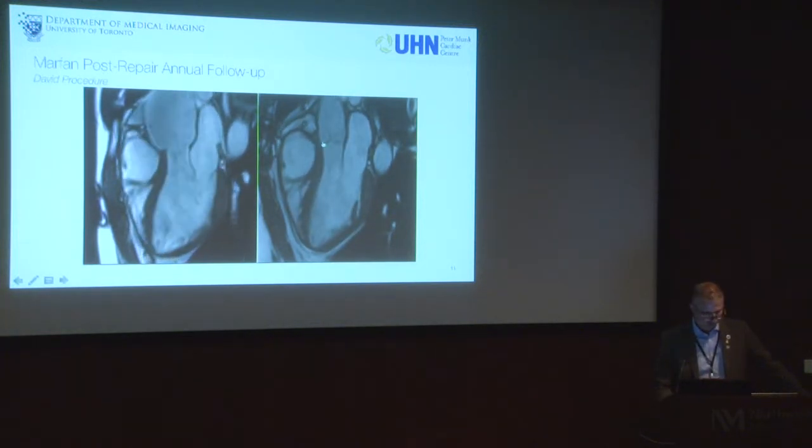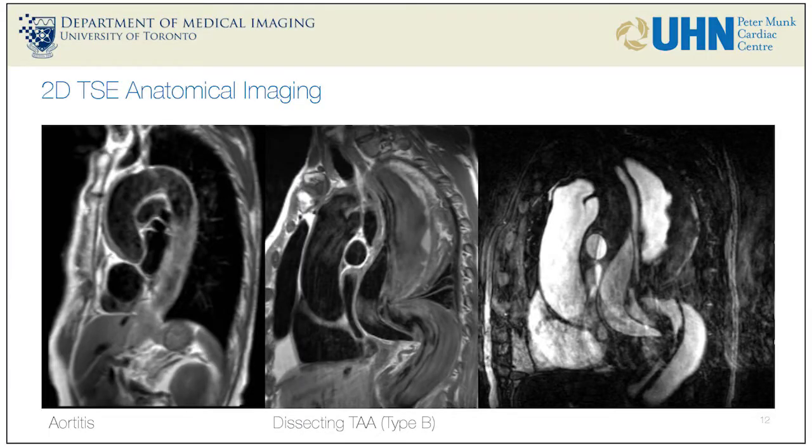One aspect you can do as well, which is something we actually perform in aortitis, we add these T1 weighted images, which is an anatomical information to see thickening of the wall, whether it has an impact. Once you talk to rheumatologists these days, they are predominantly interested about development of new stenosis, not necessarily about contrast agent uptake in the wall. They don't really care. They want to see the stenosis. That's all it matters.